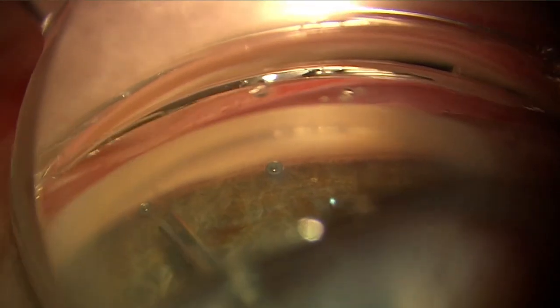We're using the iStent inject cannula here just to indicate the clock hours apart. We go straight in at 90 degrees and implant the first stent, and that goes in very nicely. We then move 2 clock hours away from the initial implant position and implant the second stent.